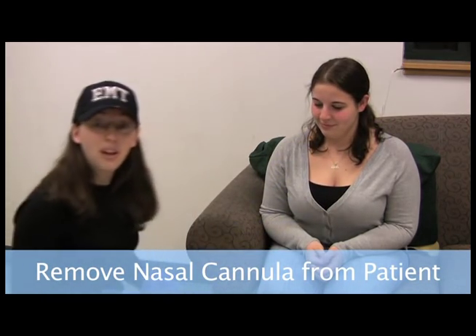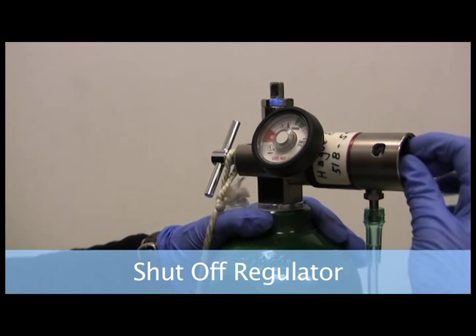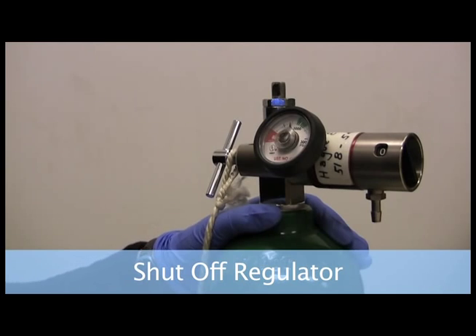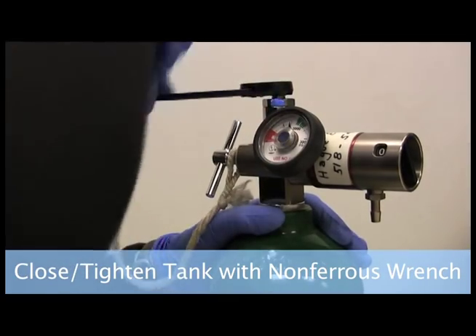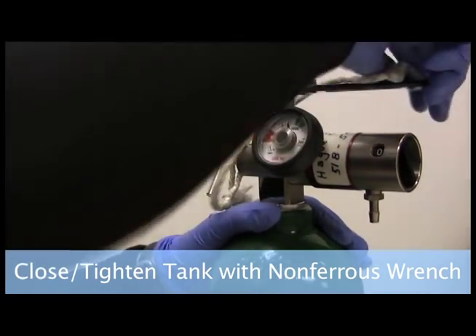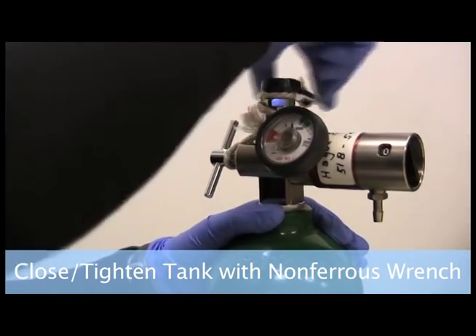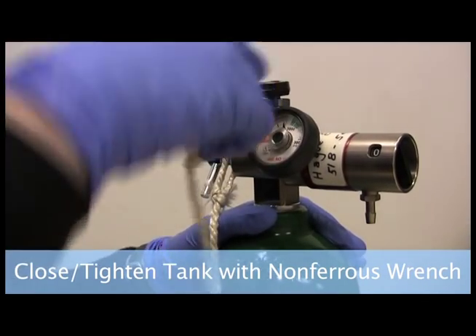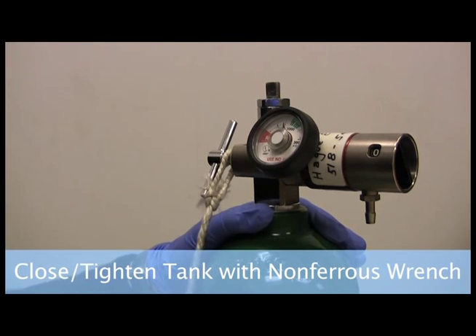And discontinue oxygen therapy. So when you want to discontinue, we'll turn that off, unplug the oxygen tubing, take my plastic wrench, we'll go ahead and tighten it back up. Remember, righty-tighty, and we know that we're going the correct way because it took us longer to go around.